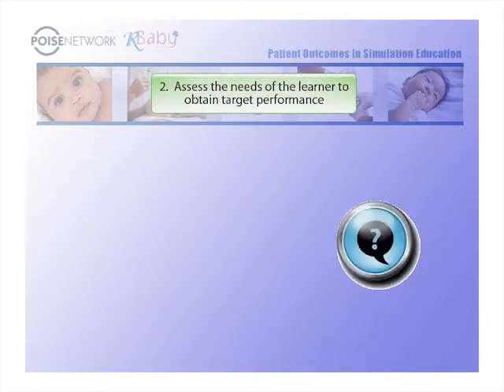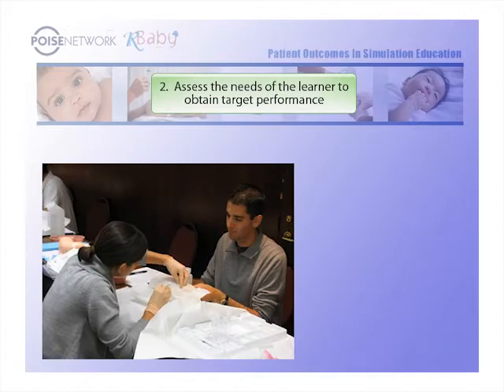During this initial observation, the learner may ask for reassurance or actual questions. Feel free to answer any of their questions verbally, but for the initial observation, you should refrain from taking over or physically manipulating the simulator or needle, so that the learner has an opportunity to work through the entire procedure on their own before you provide more coaching.